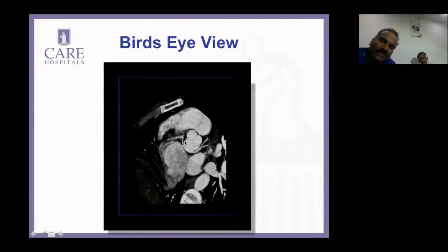These are the cases where it is very difficult to interpret lesions in the ostium and in the proximal part of the LMCA. It would be tough even if I do a conventional angiogram, because here again the ostium is oval in shape. Am I right, sir? Yes. Very true.